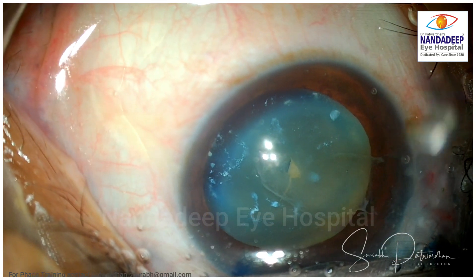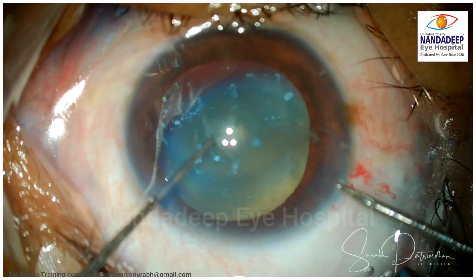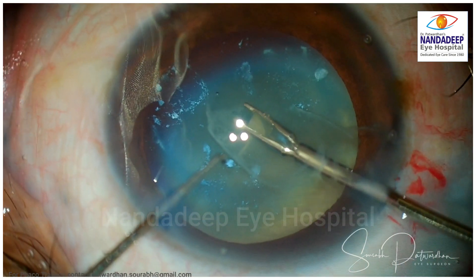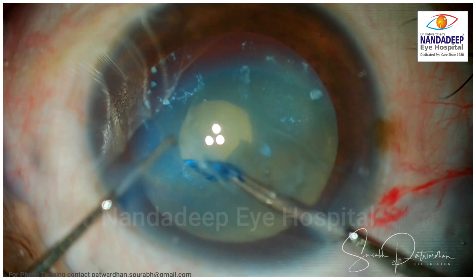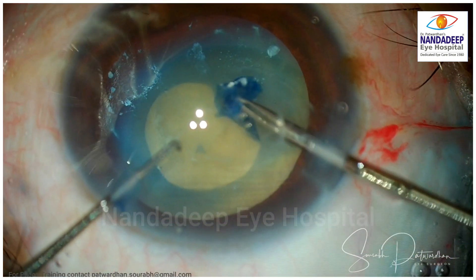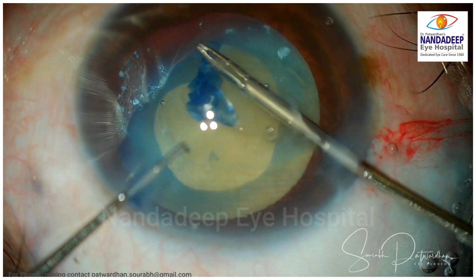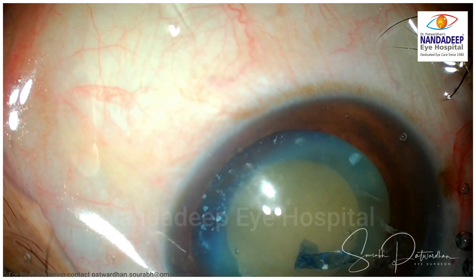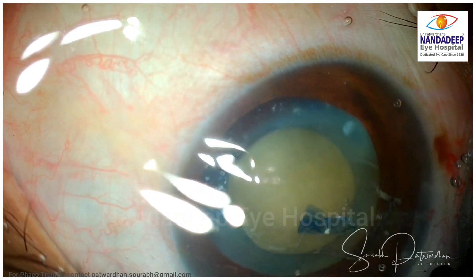Now, always move to capsulorhexis forceps — my choice is microcapsulorhexis forceps here, because with a needle you do not get adequate support of the nucleus, so always move to forceps. If you have seen my previous videos on Morgagnian cataract, the principle of capsulorhexis here is that you always pull this tear tangentially. Never pull this capsulorhexis tear centripetally in case of Morgagnian cataract, because the capsule is redundant and sometimes you may have zonular weakness — if you pull it centrally you tend to damage the zonules. So far the zonules have given adequate support, as you can see a good counter traction during capsulorhexis.